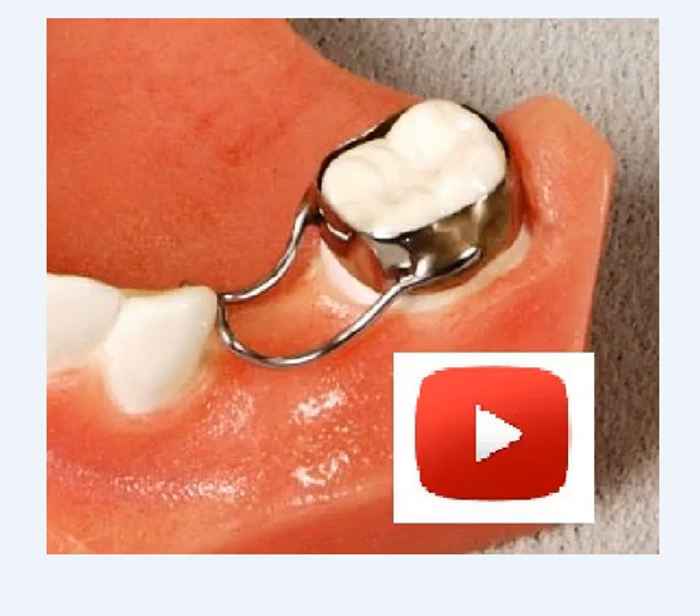This is a very common appliance we see every day here at our lab at ORDOT laboratories — a band-in-loop space maintainer.